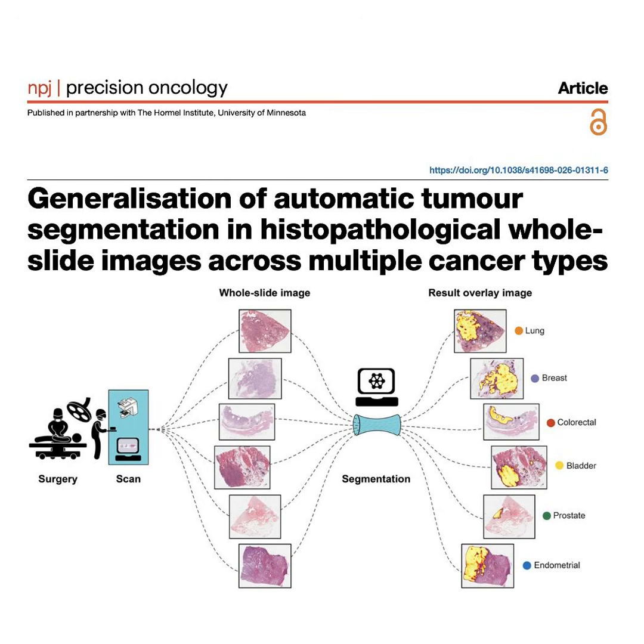Now, if a neighboring region has a lower probability, say it's somewhere between 33% and 90%, I will only mark it as a tumor if it is physically touching that 90% anchor region. Okay, it's like a localized weather system. For you listening, imagine this. If you have a massive confirmed hurricane, that's the 90% anchor, and a smaller storm cell nearby, you just assume they are part of the exact same system. Right. But if there's just a faint 40% probability cloud floating completely on its own in the middle of a clear blue sky, you dismiss it as noise. Perfect analogy. And the final result of that is a stark black and white binary mask. Black is healthy background, white is the definitive tumor. Okay, so it cleans up the scattered low probability noise perfectly.